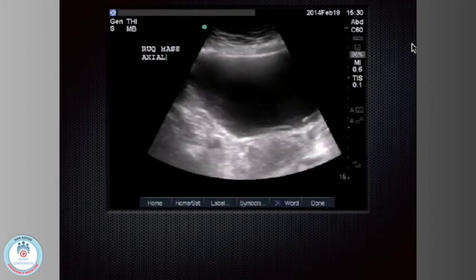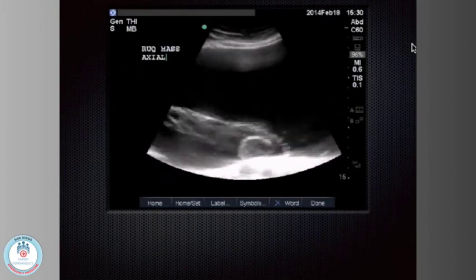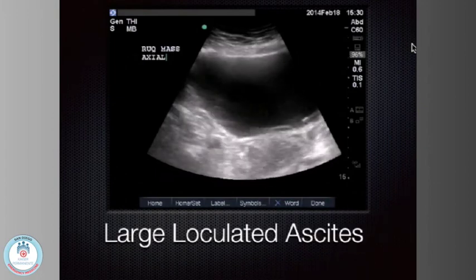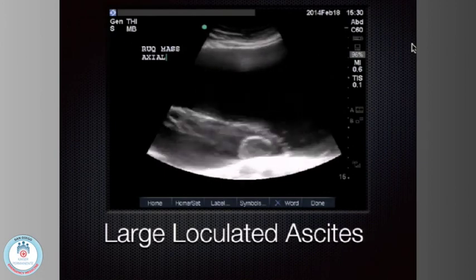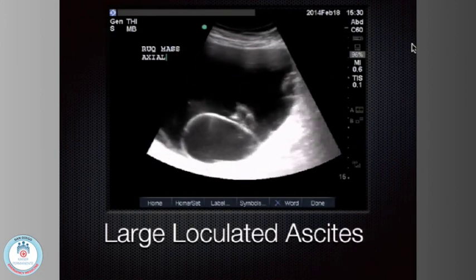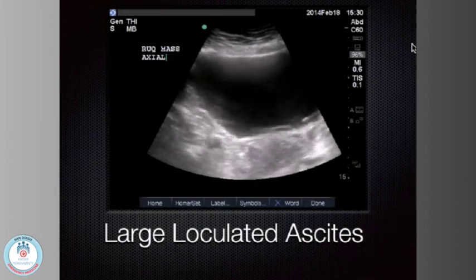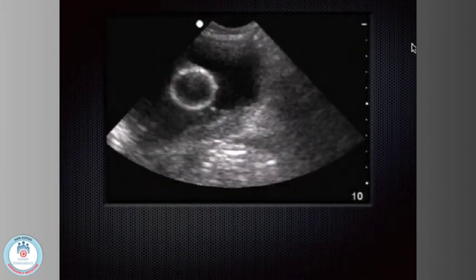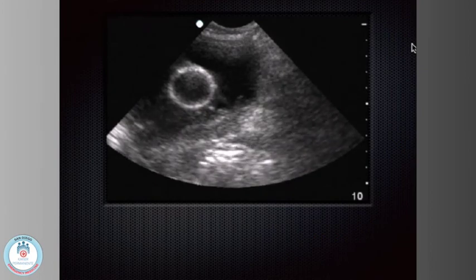What's this? Yeah, it's just some ascites. I think loculated ascites, just lots of loculations. You can drain most of this, but you might end up spending a lot of time trying to guide into all those loculations and have IR take care of that. But if the patient's really hurting, you could do it.